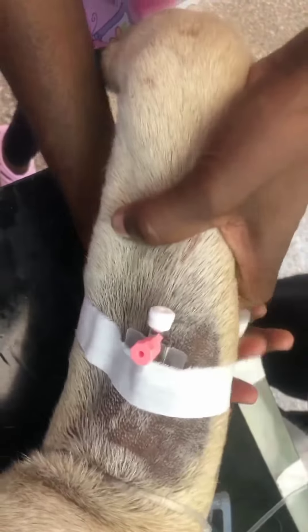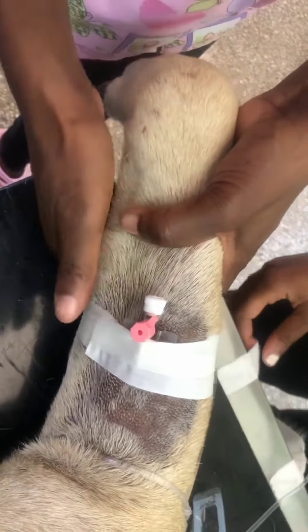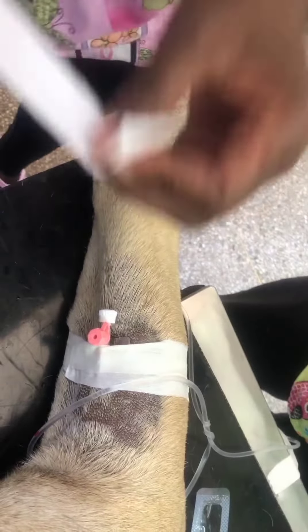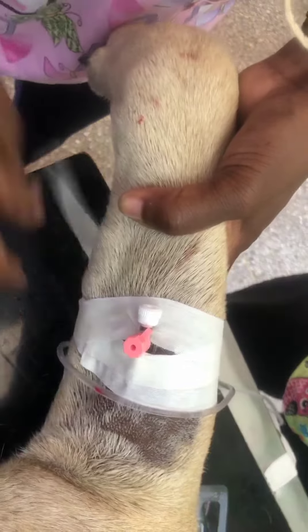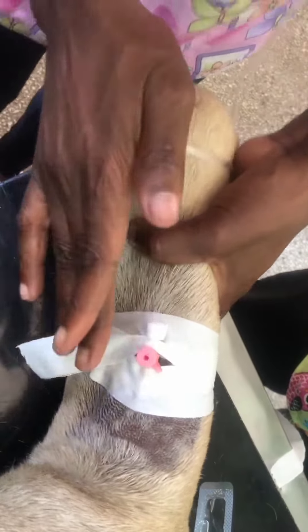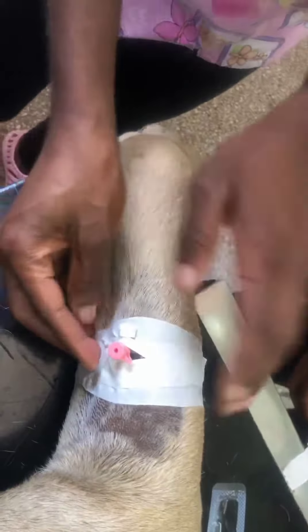You can secure the catheter or cannula however it is — make sure it's secure. I'm using elastoplast, or plaster as others would say. You can use vet wrap, you can use whatever is there. Just make sure it's nicely placed so that the dog cannot easily remove it. Also, if they're very dehydrated, you don't want to place it loosely and then have it easily come off, because then you have to look for the vein again and they might be even more dehydrated.